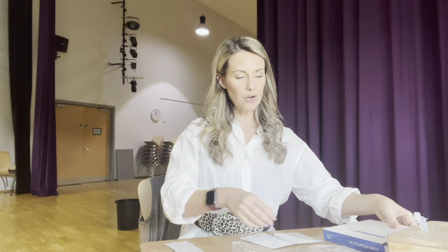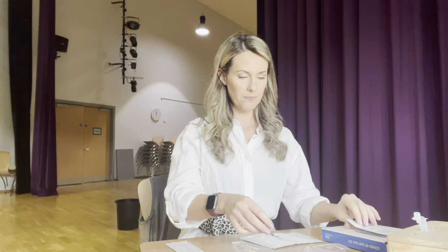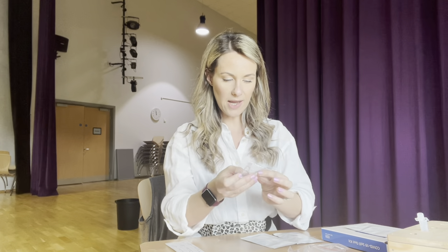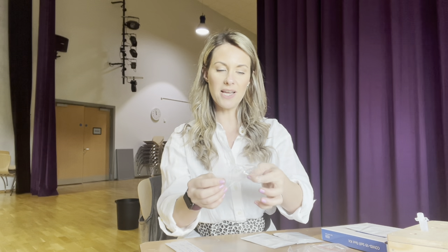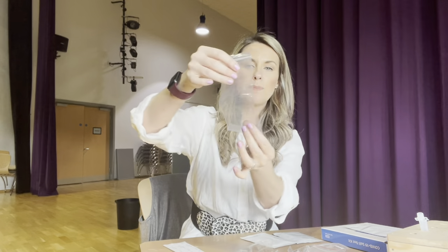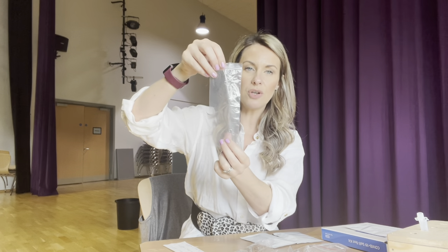Inside the kit you're going to find seven of the self-test kits, seven of these little test tubes, seven of the extraction buffer sachets that have liquid in, seven of the disposable sampling swabs, and seven of these bags to dispose of everything after you've used them.